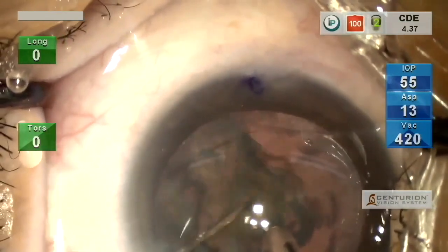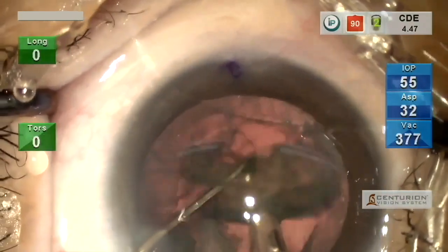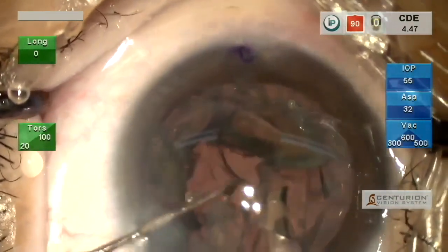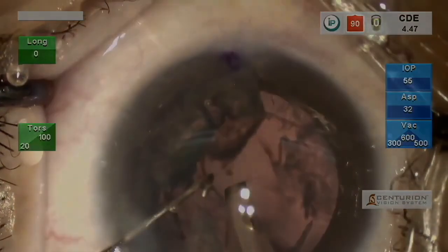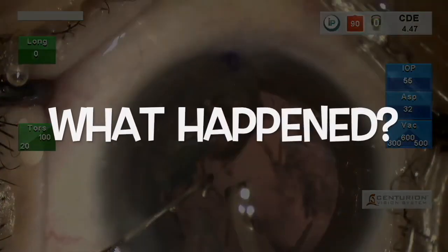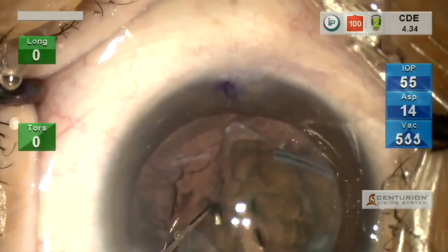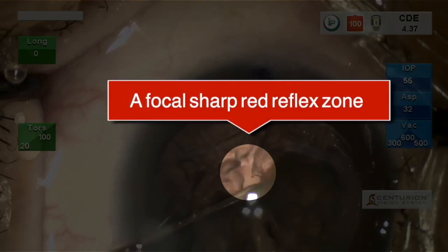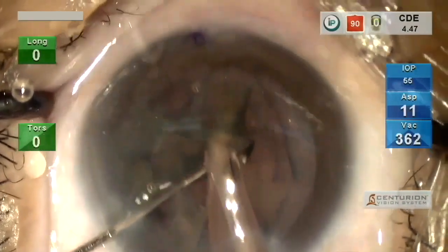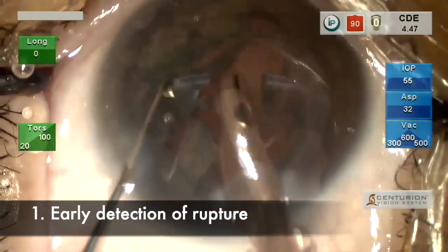outcome. In the beginning, the junior surgeon did pretty well. But when she was removing the last fragment of nucleus, a sudden deepening of the anterior chamber occurs, and the posterior capsule bows posteriorly. What happened? A focal sharp red reflex zone behind the residual lens material can be identified. You'll find it's hard to focus on the hole. Certainly, early recognition will limit the problems. Pausing for a moment and identifying the PCR are very important.